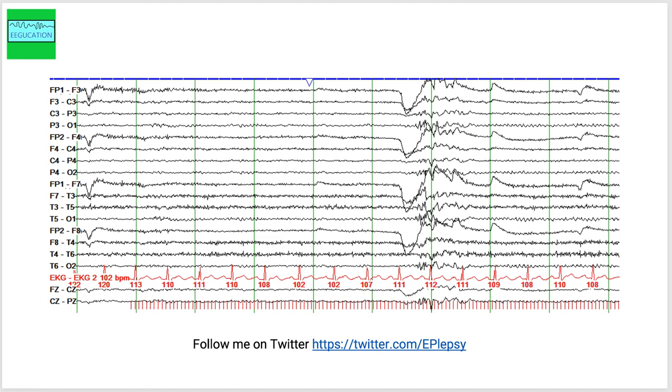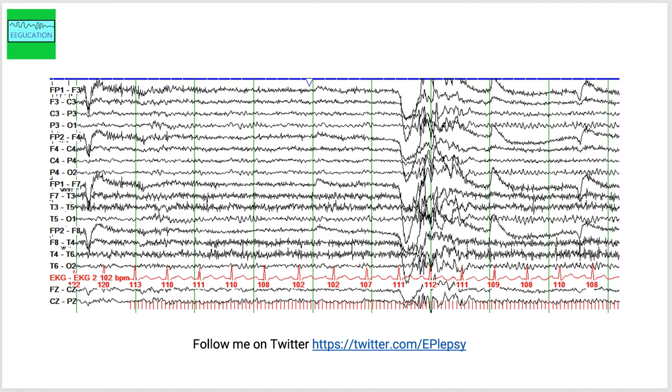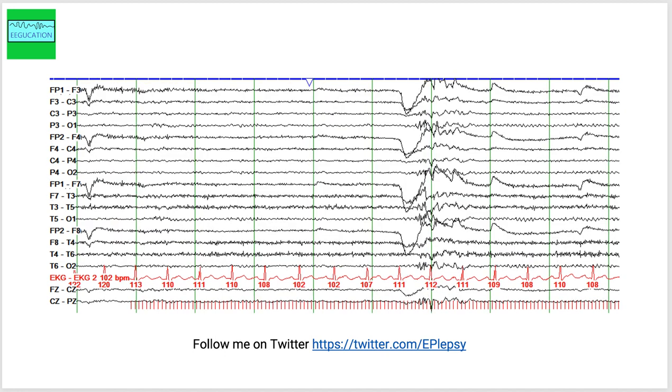This is what we call the photoparoxysmal response. It tells you that a person is sensitive to flashing lights.